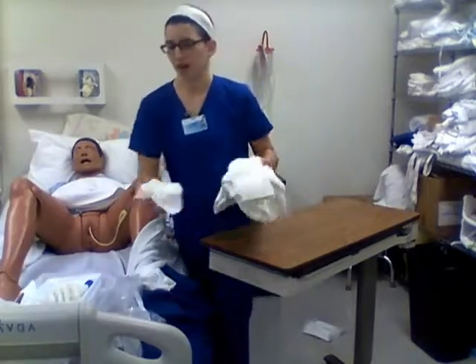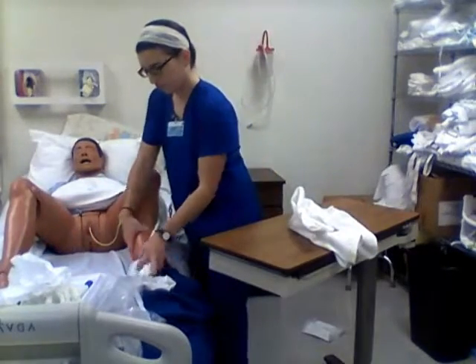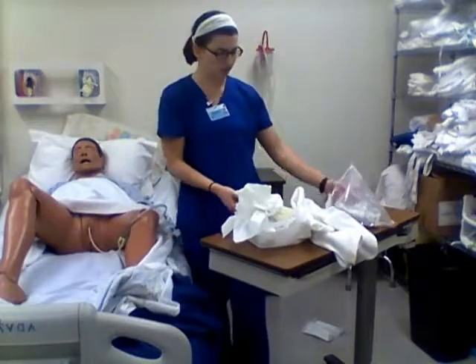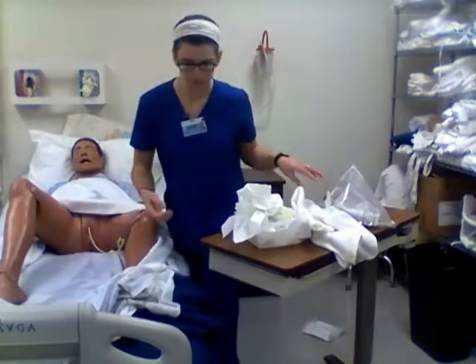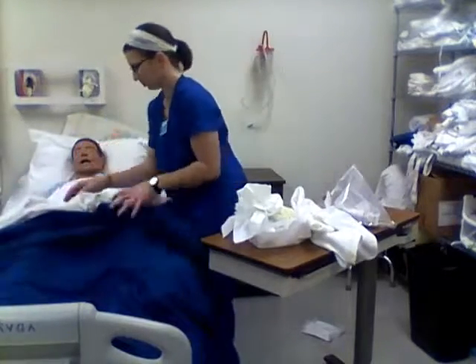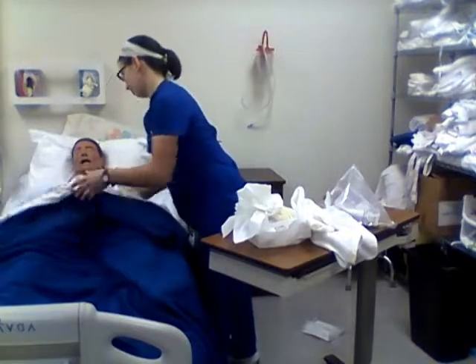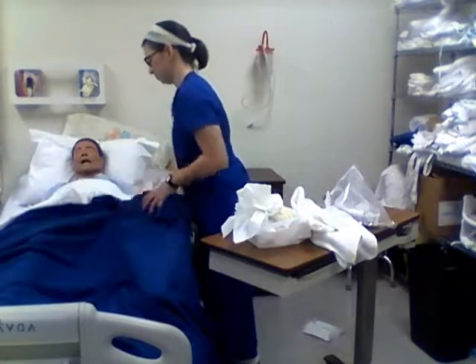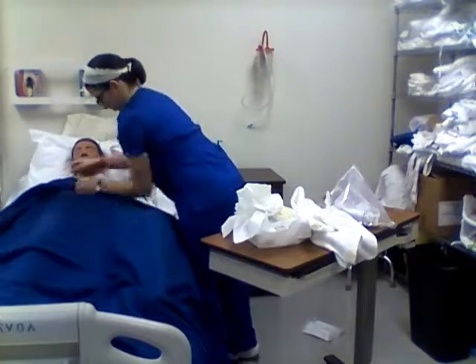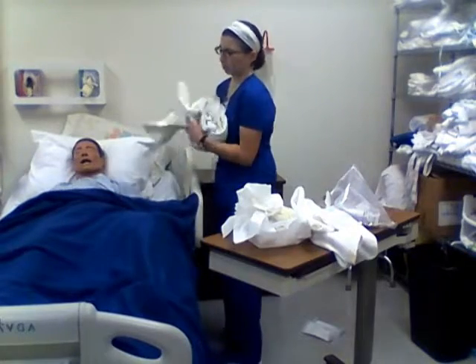All of this is thrown away. My towel is in the laundry hamper now. And so now I can go ahead, make her comfortable again, back to where we found her. So I can put her legs down. Roll up. Pull her gown back down while I'm at it. All right, and this would go in the laundry hamper as well.